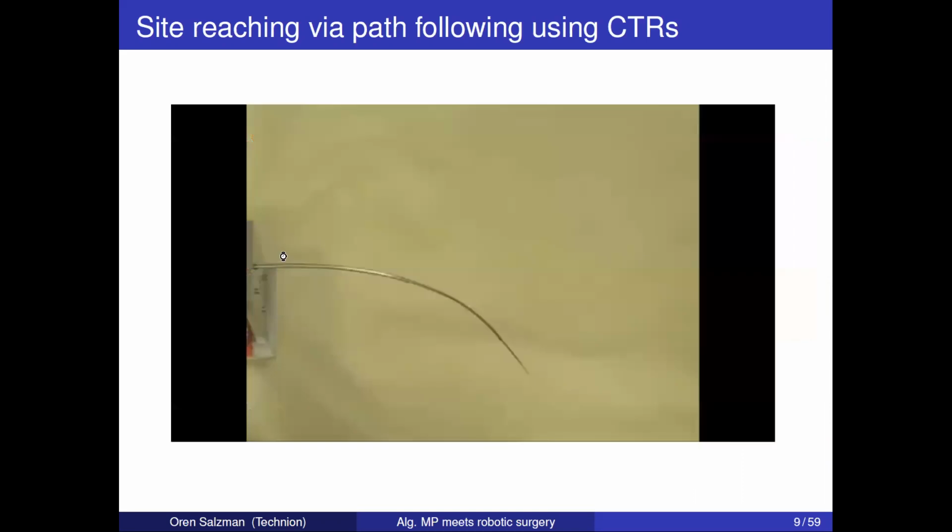And this is a video depicting the motion. And I hope you can see it's kind of like an elephant trunk-like motion, which is really cool, but also really unintuitive. If you need to try to do this manually while avoiding obstacles, it's infeasible for any user.